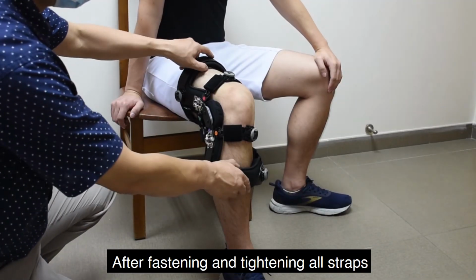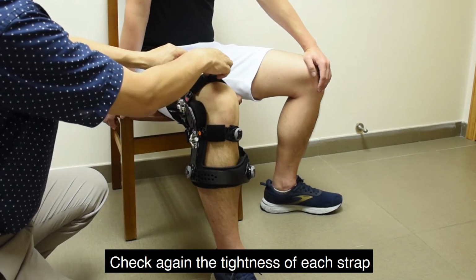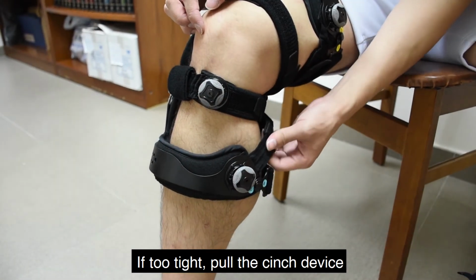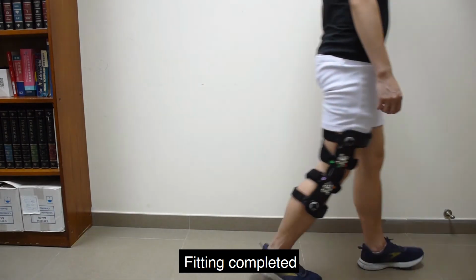After fastening and tightening all straps, check whether the brace is in a proper position. Adjust it if needed. Check again the tightness of each strap. Further tighten the strap if too loose. If too tight, pull the cinch device. Press again and turn to fine-tune the tightness. Fitting completed.